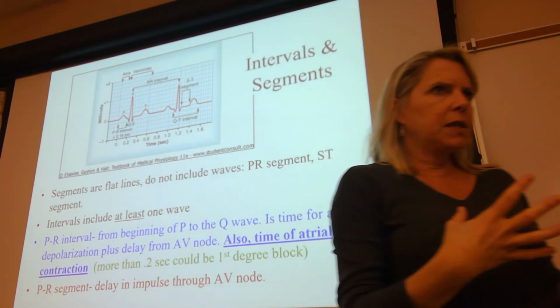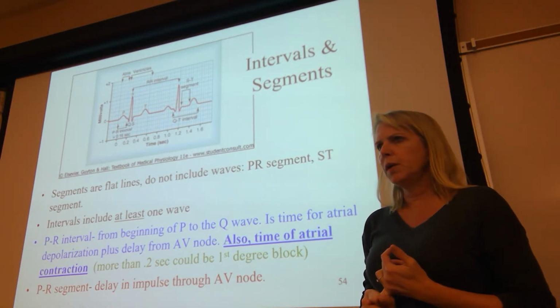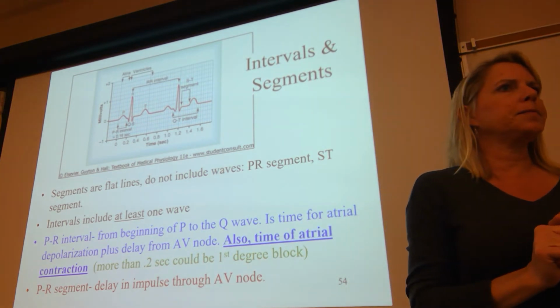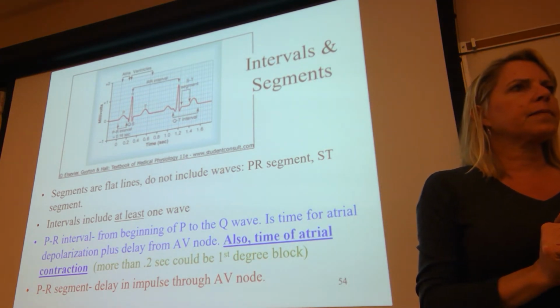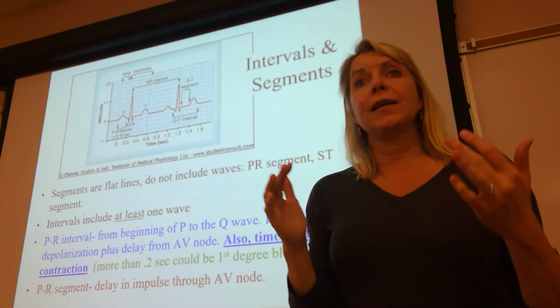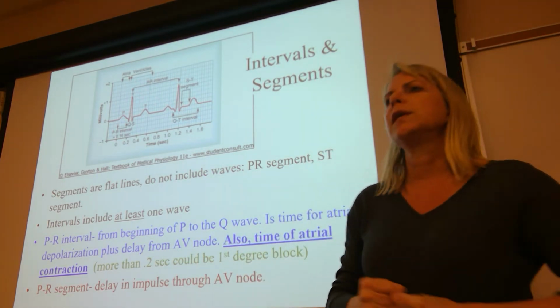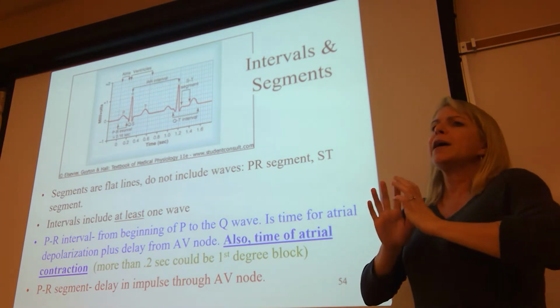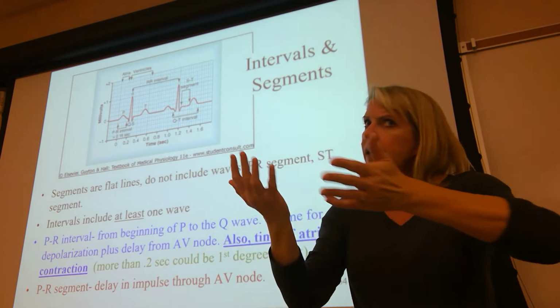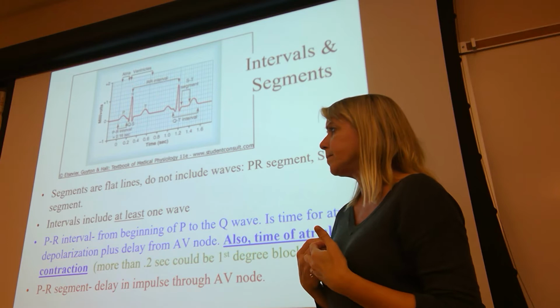why are those segments significant? The ST segment, as I just showed you, that is when the ventricles are contracting and we're getting stroke volume. What's the importance of the TP segment? That's when the heart is at rest. That is when it's getting its well-deserved rest, it's filling, and we're getting blood flowing through the coronary arteries. That is the only time when blood is perfusing the myocardium.